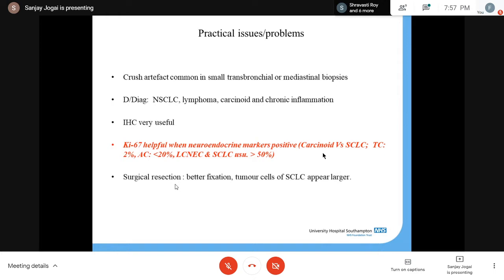So a good idea there is to give a summary. The way I express it is, as a bottom line, I would say high-grade neuroendocrine carcinoma, but within the free text describe that there are areas within this tumor which look like small cell. However, in other areas, there are features of large cell neuroendocrine carcinoma. Invariably, the clinicians would be treating these cases as small cell. But as a pathologist, we are most appropriate when we can express that dilemma.